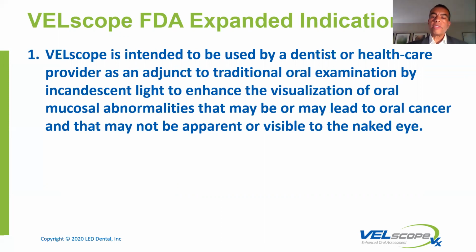One of the reasons is sometimes because they've never heard about this before, and they think it's maybe a gimmick. If it's about oral cancer, why isn't my physician offering this? So one of the things you can do to respond to that cynicism, that questioning about the technology, is confirm and let them know this is FDA approved. This is actually meant for us to use to assist us in identifying abnormalities, preferably at the earliest possible stage. And you can use other references like a Pap smear, a mammogram, PSA, what have you.